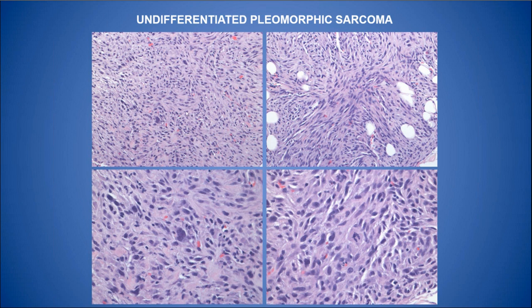But mainly, smooth muscle actin, desmin, and myogenin should be negative in these tumors. Most of the time, at least you will see positivity for vimentin. You may see focal and weak positivity for actin. You may see CD68 positivity. I have seen tumors with CD34 positivity, usually not diffuse, but everything is really non-specific. And watch out, they may be positive for epithelial markers like keratin, in which case the diagnosis of sarcomatoid carcinoma has to be excluded.